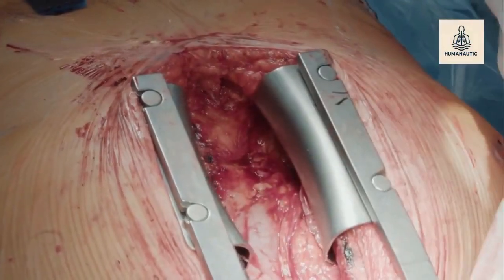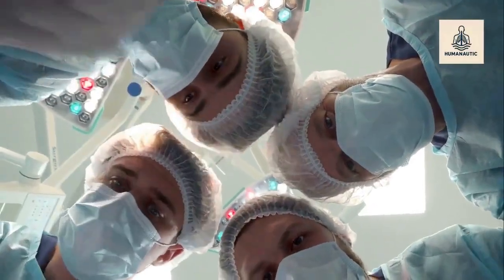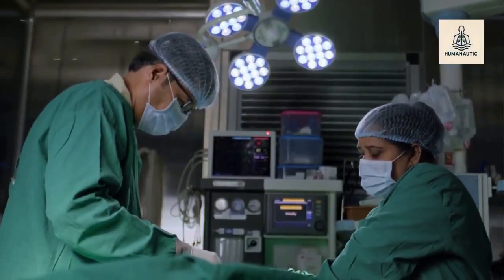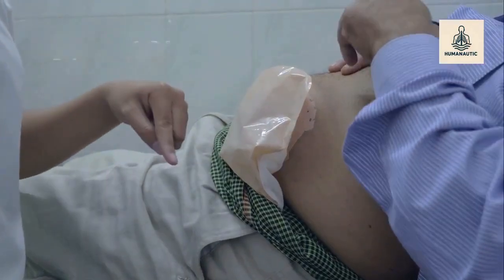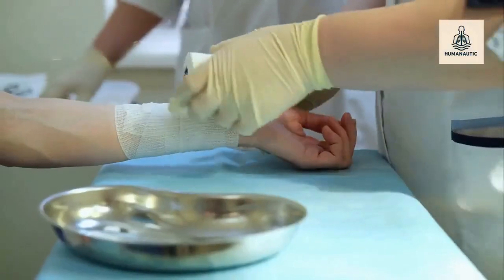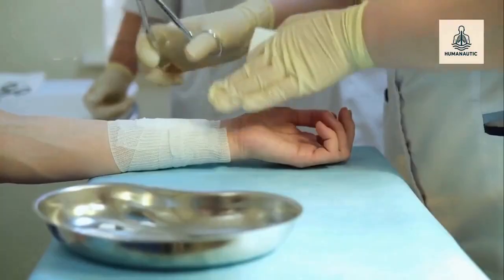Indications for debridement. Wound debridement is indicated when there is necrotic tissue, slough or eschar, infected material, foreign bodies, or chronic non-healing wounds. Common clinical examples include burns, infected surgical wounds, and diabetic ulcers.